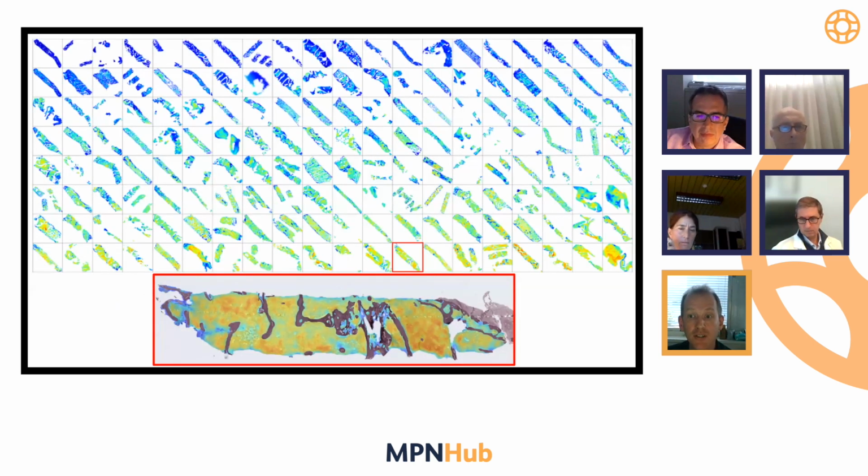So this is just a single view of all the samples on the trial. This is a myelofibrosis trial for patients who have been either heavily pretreated or have a long-standing diagnosis. And if you'd shown this to me at the beginning, I would not have guessed this was a collection of patients, all of whom had myelofibrosis. Many marrow samples here are really not very fibrotic, as compared to those in the bottom right, which have quite severe fibrosis. So very, very heterogeneous group of patients, even before doing any analysis, which was a bit of a surprise.